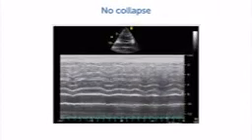And this is something that Bruno taught me. There's another view that you can use. Yeah, there is a second possibility to get the IVC in our transthoracic examination. And it's exactly along the right mid-axillary line. You have to put the probe here on the liver high, and then we look for the biggest vessel that we can see. But you have to watch out not to get the aorta, right? Exactly. So I would suggest to follow the vessel till we can see the right atrium.